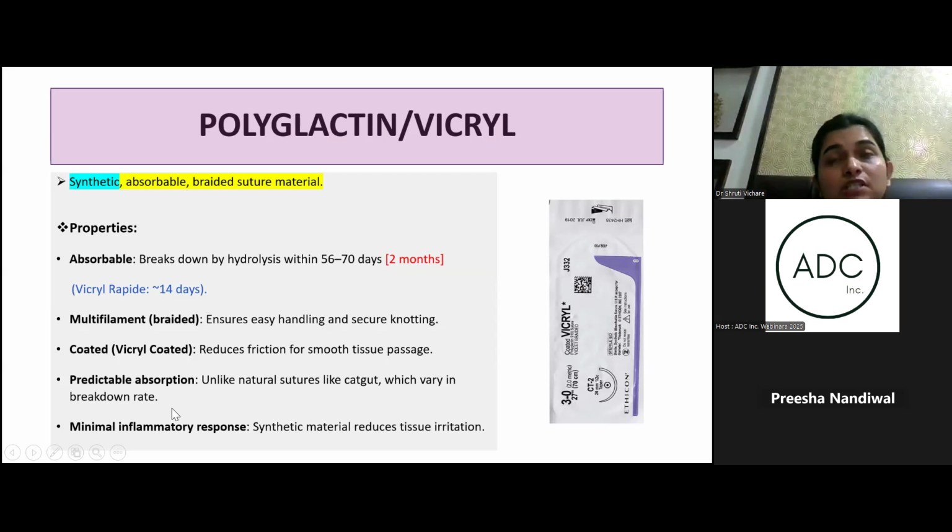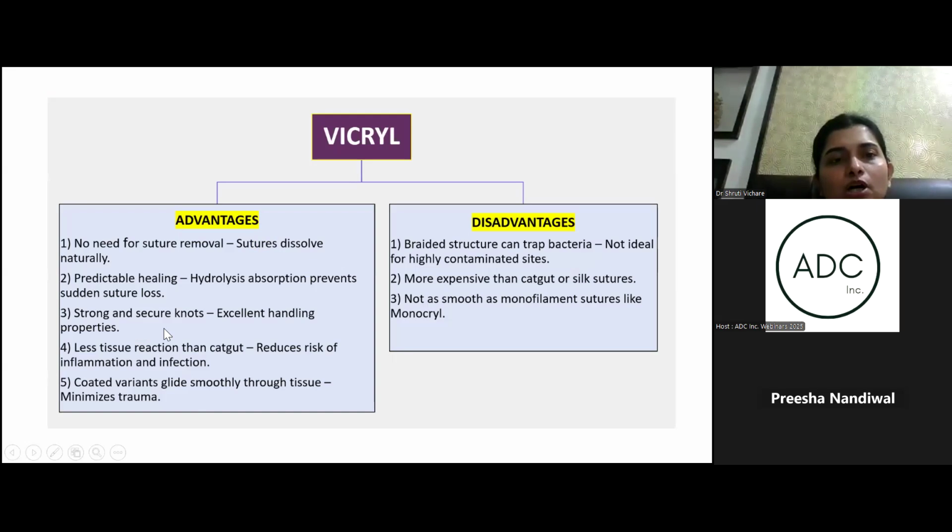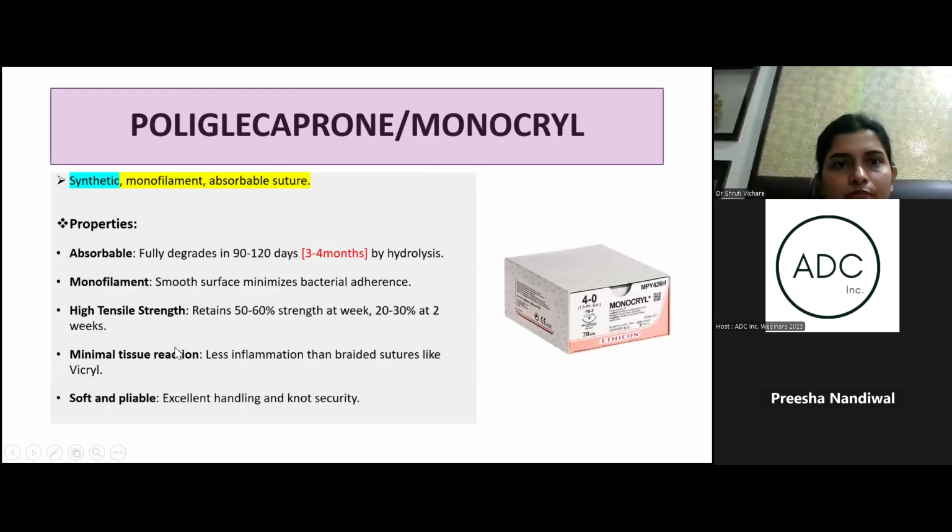Now, absorption is much more predictable. It is not unpredictable like surgical gut suture. So they will never disappoint you. They will never get resolved before time. Now, minimal inflammatory response because they're synthetic sutures. Always remember, natural sutures will inflict more foreign body reactions than the synthetic ones.